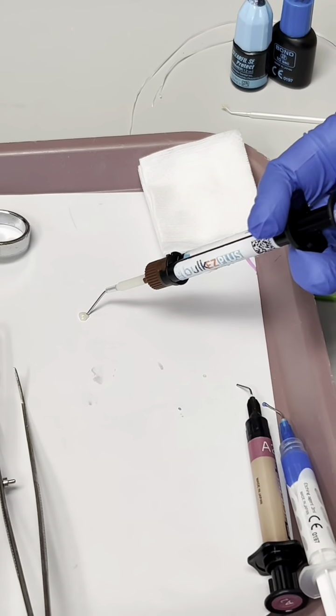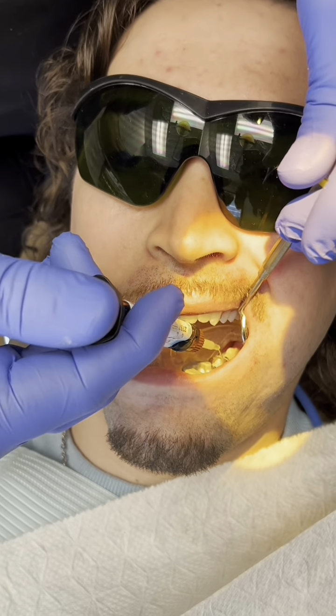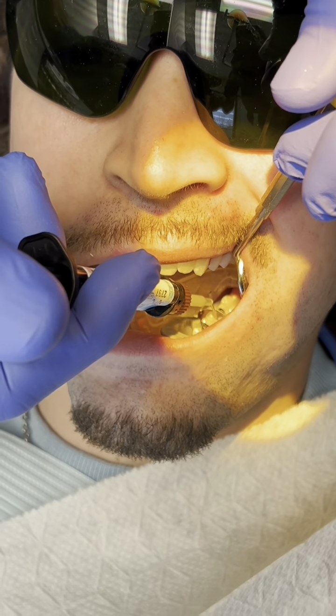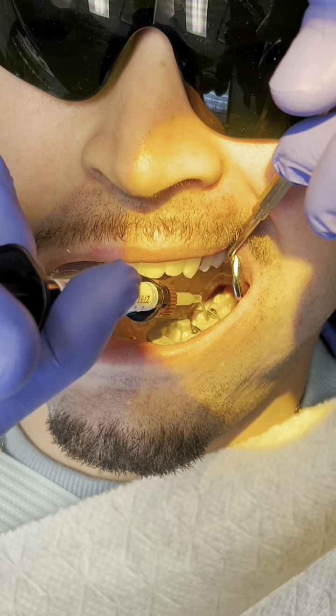This is my go-to in terms of dentin replacement. With dentin replacement, one of the biggest things is the depth of cure that we're trying to acquire with any type of composite resin restoration we're providing. With depth of cure, what do we need? We need a great curing light. And with the depths we're reaching in some of our deeper restorations, we can't ultimately get a good cure down in those deepest parts.